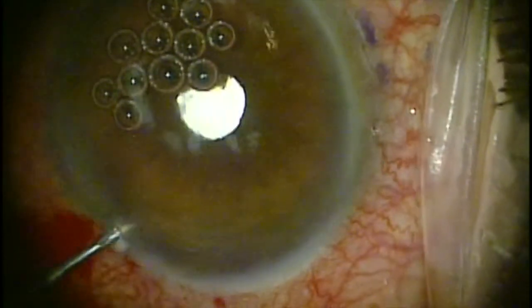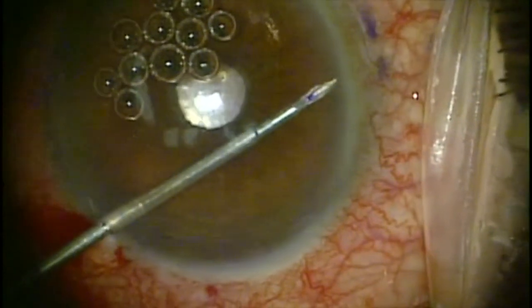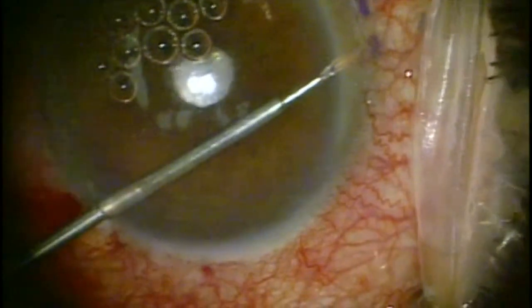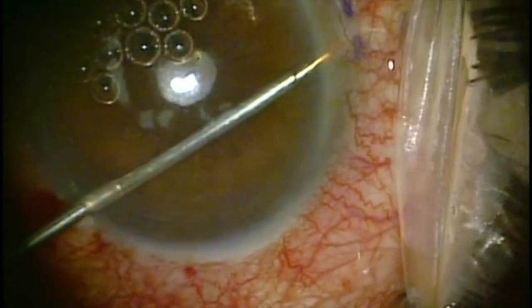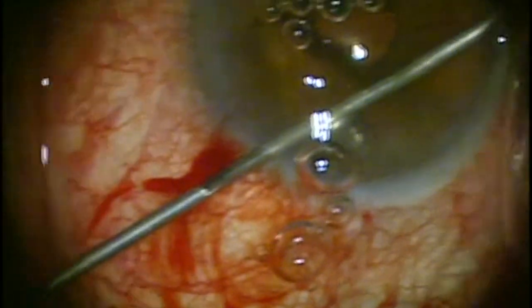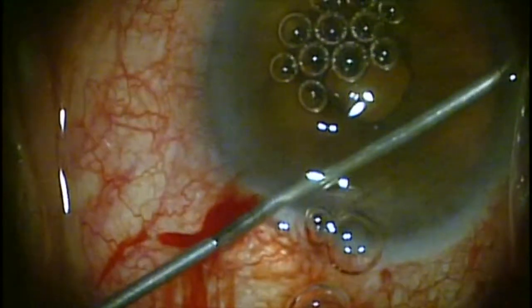I found the easiest way to hold the injector is between your pointer finger and middle finger and advancing the slider with your thumb. The device is introduced into the eye and brought over to the angle to where you approximately think that it should be inserted. Ideally, it is placed right through the trabecular meshwork and angled up toward the second marking. Here we confirm the initial placement with gonioscopy and adjust the position of the needle if necessary — in this case, we didn't need to.